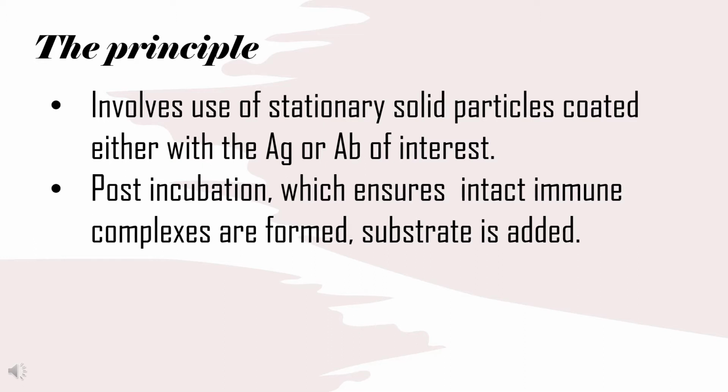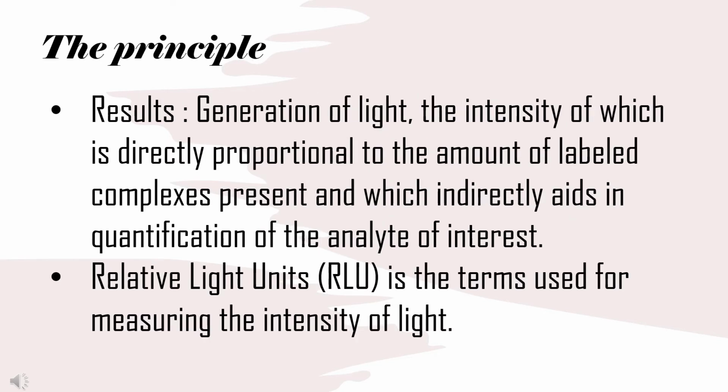Post-incubation, which ensures intact immune complexes are formed, substrate is added. This results in generation of light, the intensity of which is directly proportional to the amount of labeled complexes present and which indirectly aids in quantification of the analyte of interest. The intensity of light is measured in terms of relative light units, RLU.